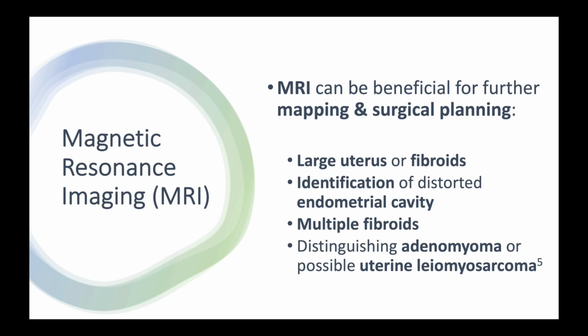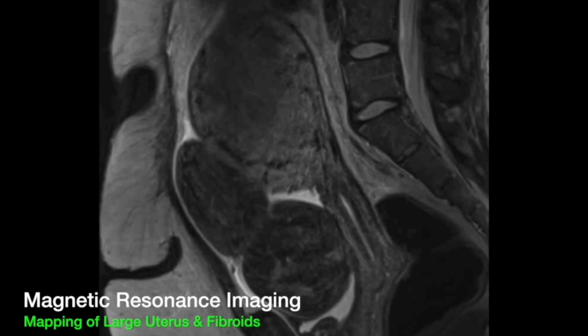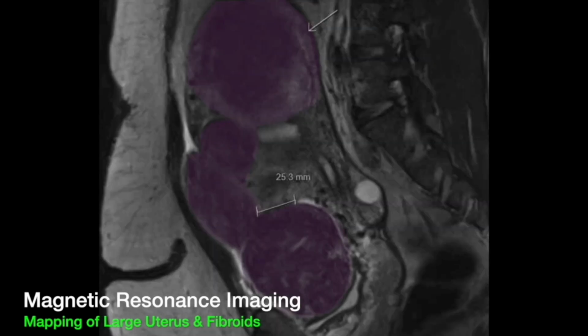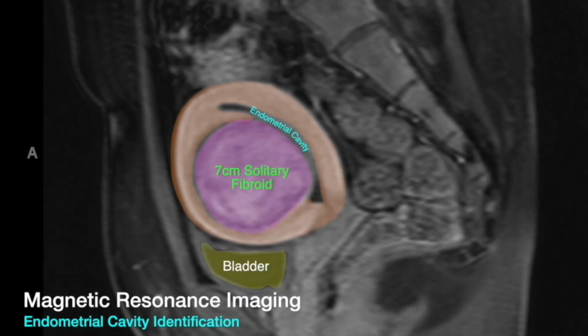MRIs are particularly useful when more detail is required, such as in the diagnosis of a large or multifibroid uterus, or to identify a distorted endometrial cavity. MRIs are also useful to identify possible adenomyomas or leiomyosarcomas. This MRI was particularly useful for surgical planning in the setting of a large fibroid uterus, and this MRI was useful for endometrial cavity identification.